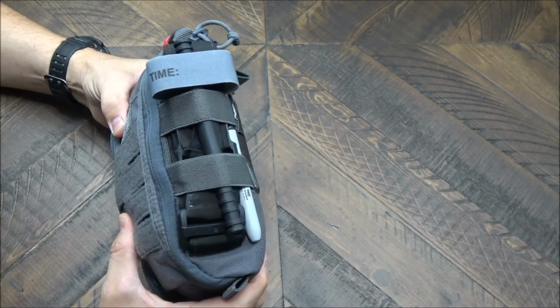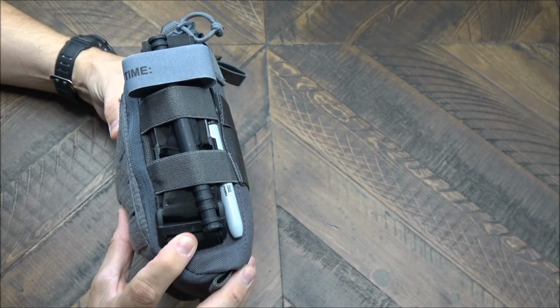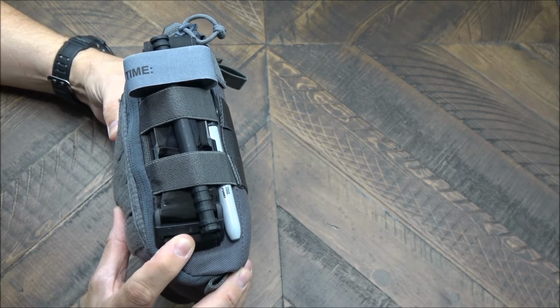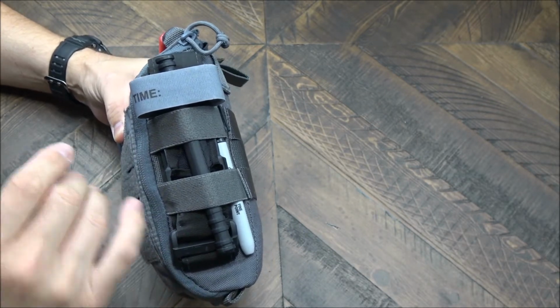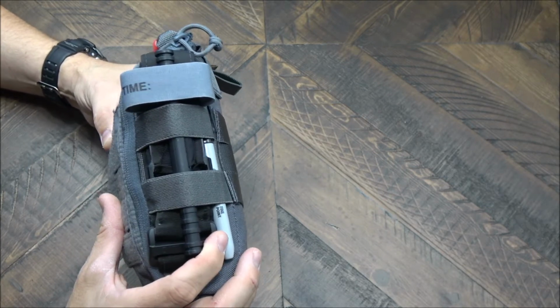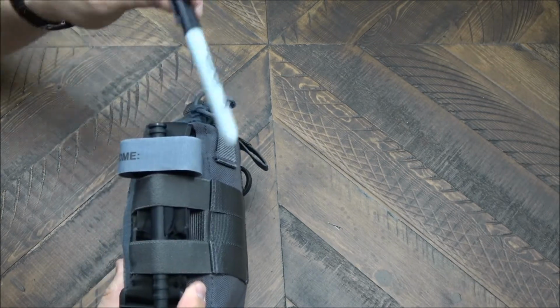On this side, you'll notice that I've got a tourniquet. This is the Generation 7 CAT tourniquet from North American Rescue. I've been seeing a lot of questions come up about what's so special about this one, and what's the difference between this one and the previous generations. I'm actually going to be doing a video of that, so stay tuned to the channel and I will address those. Next, you'll see that I've got a Sharpie pen.